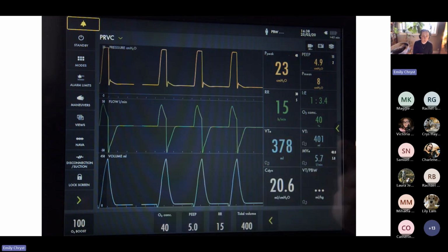When we get our patient on a ventilator and we've initiated ventilation, this is the screen that we're going to be looking at. So there are a couple things that I want to point out here before we go into more specifics. But these down here are going to be the settings that we set. This is going to be different depending on the type of ventilation that you're using, but these are going to be settings that we have actually inputted for the patient.